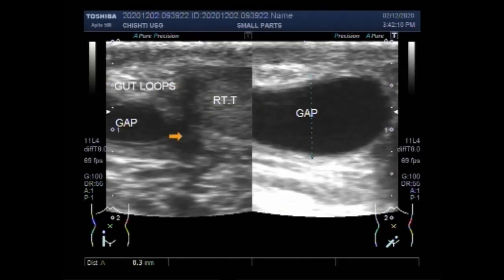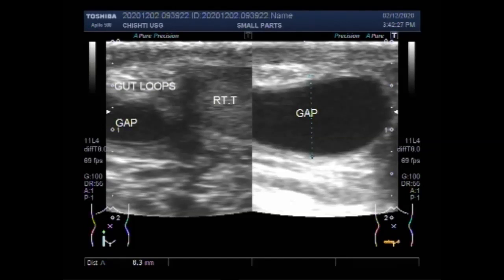Now you can see all the findings are visible: the fluid collection, the gut loops in the inguinal canal, and you can focus by adjusting the depth, focus, and gain of the ultrasound machine.